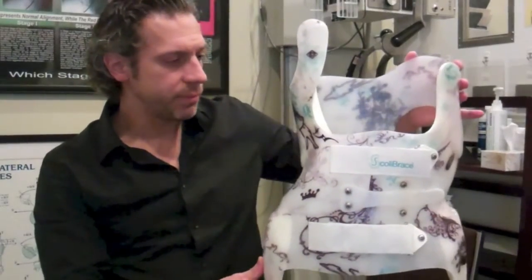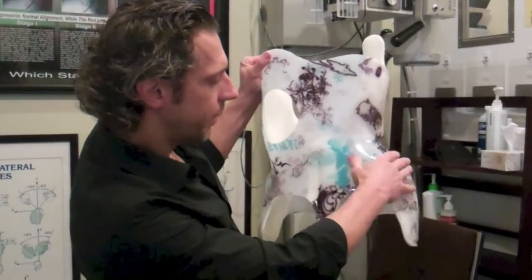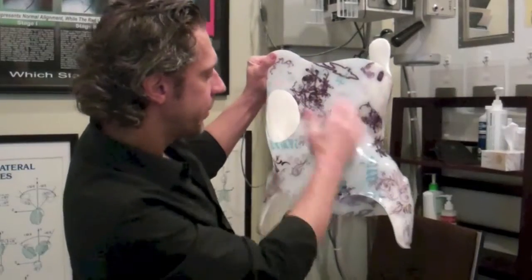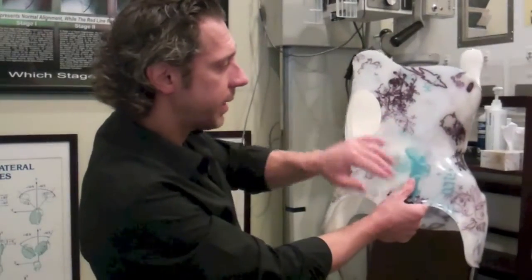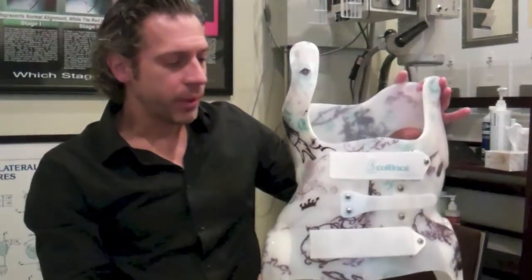You can see how this is very not symmetrical whatsoever. You can see here that the hip is out on this side, pushing the rib cage and torso over to the left. And you can see here that it's wedging in here over the hip. It's more symmetric on this side, but not this side. And the reason why is because the patient actually is oriented in the complete opposite manner.